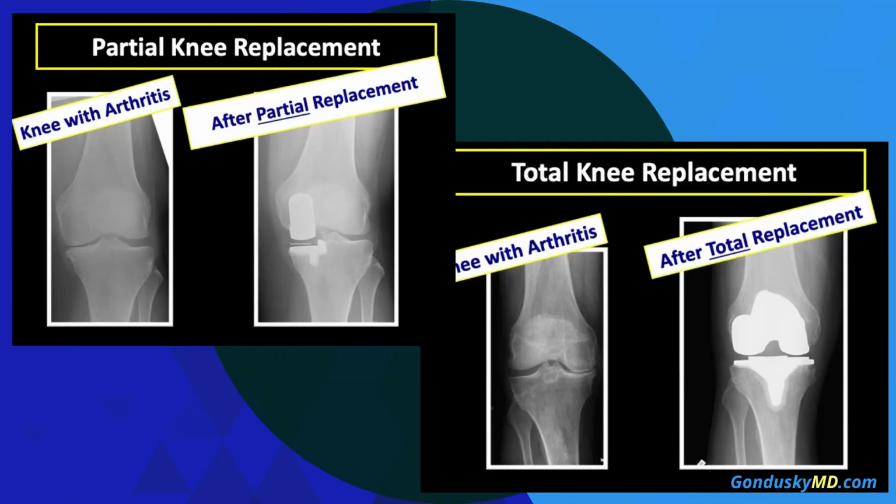And there's a little bit of gray area in there where we have discussions about pros and cons of partial versus total knee replacement. But for the most part, they're great for young patients where we know that we can give them some good pain relief, but that even with total knee replacement, a revision could be required in their lifetime, or for older patients where a less invasive surgery is lower risk, and we can get them through this with little to no pain and a good outcome, and that will likely survive them forever and take away their pain. So that tends to be the patients that we'll do partial knee replacements in.